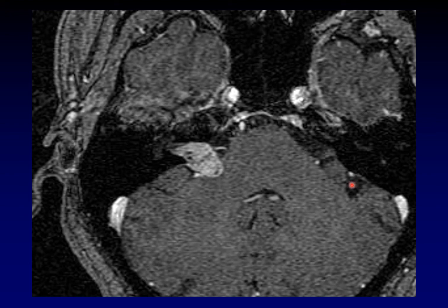How about this one? This mass goes into the internal auditory canal. It's widening the porus acusticus, and it's kind of heterogeneous, but not that much. So there's some features that say acoustic neuroma, but then look how broad-based it is. The widest part of the tumor is definitely the part that's up against the bone. So it's more or less homogeneous. It's got a broad base. Is this going to be a vestibular schwannoma or a meningioma?